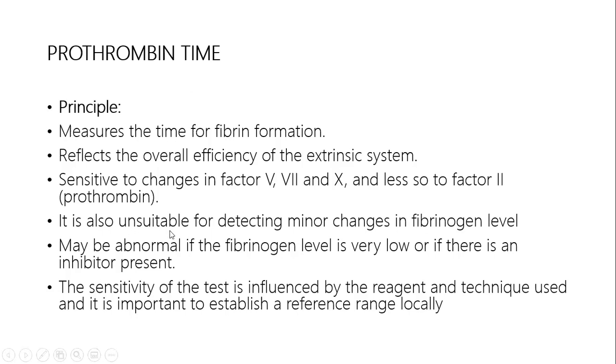It is also unsuitable for detecting minor changes in fibrinogen level. So basically, example, kung nagnubo jutay ang fibrinogen level ng pasyente mo, wala na effect sa prothrombin time. But kung nagnubo ang fibrinogen levels ng pasyente mo, or kung may ara inhibitor, again, nga present against sa clotting factors 5 mo, or 7, or 10, or 2, pwede mangin abnormal ang imo nga prothrombin time.